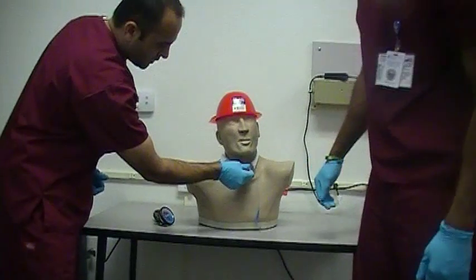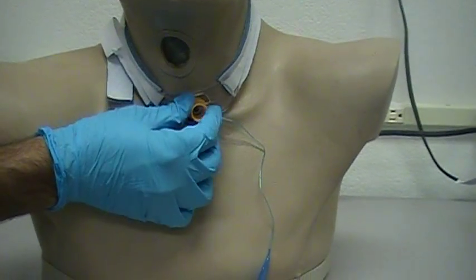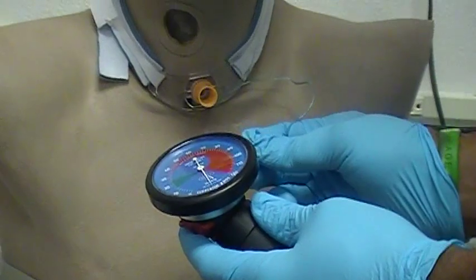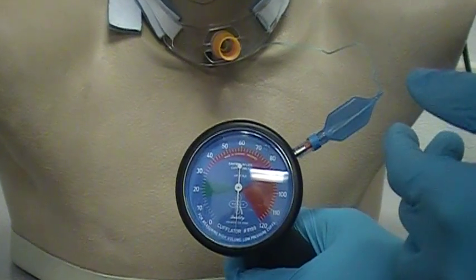We'll just insert the tracheostomy tube into the stoma over here. So this is what it is. I'm going to go ahead and inflate the cuff now. When I first squeeze it, I'm going to try to bring it up to about 50 — kind of overshoot it a little bit.